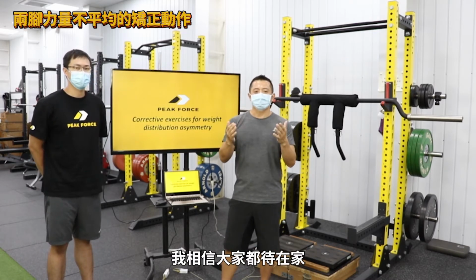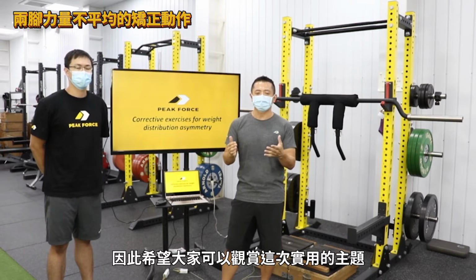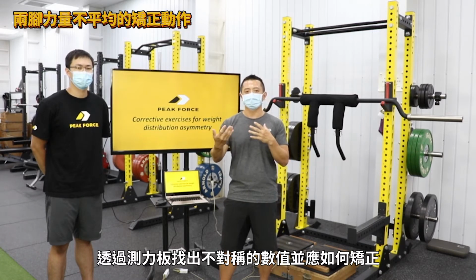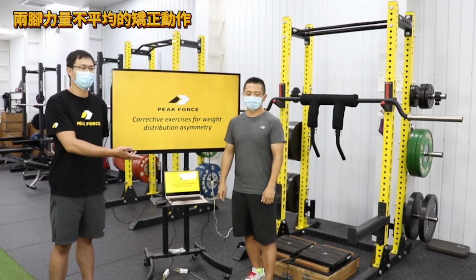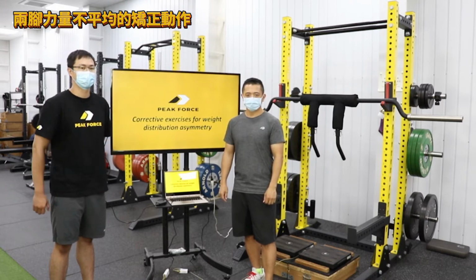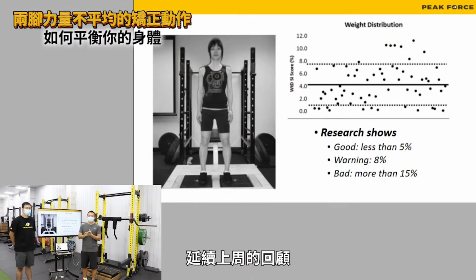Hi, this is Dr. Sato. I'm sure that everybody is staying home and not much special to do, so I hope you guys can watch this practical session using a force plate and looking at some asymmetry value and then how do we actually approach to correct it. Okay, so from last week's review, I mentioned about the weight distribution asymmetry.